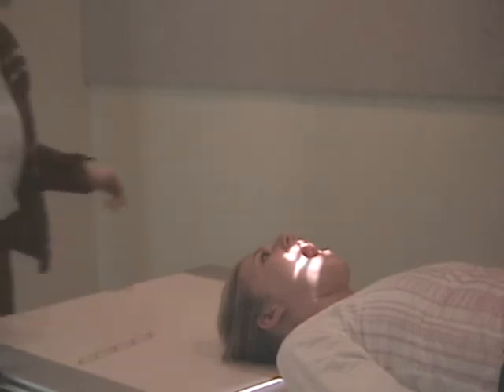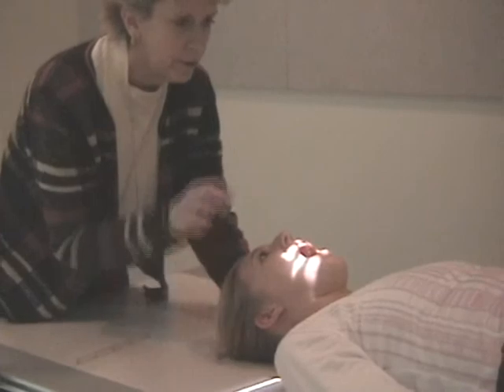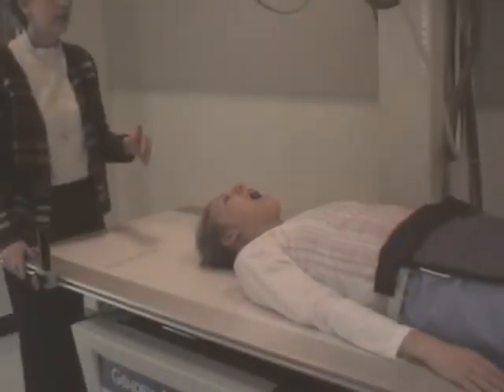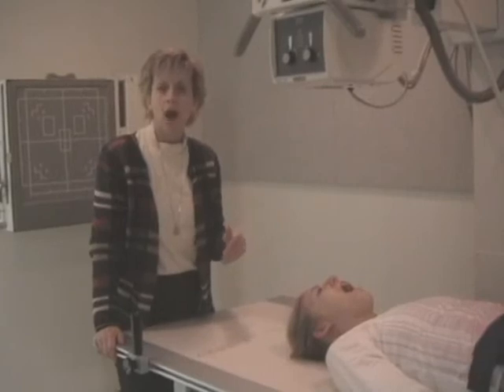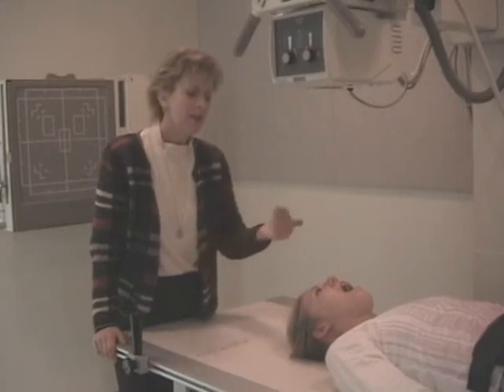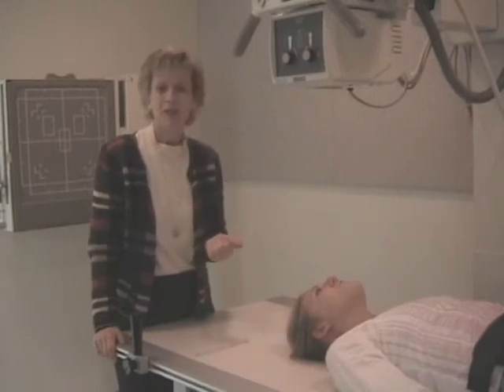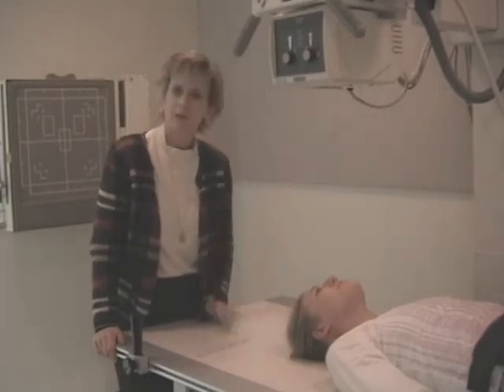Patient's holding their mouth as wide as they can, and again, you make sure that the MSP is to the center of the film, patient is straight, and that there's no rotation, no crooked head, and that the distance on the two sides of the face is equal. And you make your exposure. Some techs will ask the patient to make the ah sound. If the patient can make the ah sound, the tongue tends to drop down a little bit more. This is the one that I was referring to at the beginning of the procedure about needing a tongue ring, a plug. The tongue ring will be right over the spine.